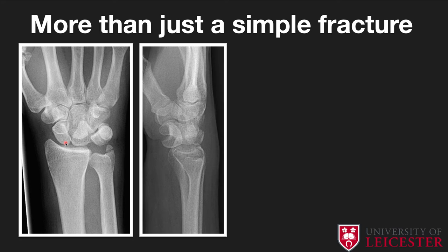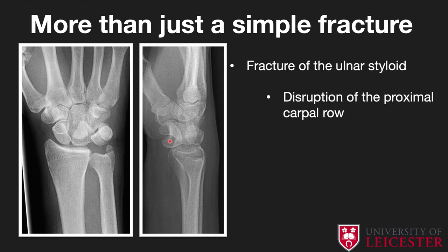Another example of more than a simple fracture: on the AP radiograph there is just an ulnar styloid fracture, the radius looks fine, but the capitate looks odd as it should articulate with the lunate. Instead of a normal boat shape, the lunate shows a triangular appearance. On the lateral view the lunate has flipped out — this is a classical lunate dislocation.